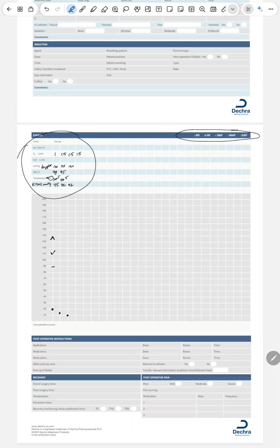So just like before, we would be able to say 1. And on this one, because the legend doesn't tell us that here, A started here, anesthesia, and then here's a circle that states surgery started here. We don't have any symbols like that. So I'm going to say number 1, this is start anesthesia. And then over here, after we're done prepping, 2 is start surgery. Or procedure, or whatever you want to say. And you can write it like that.